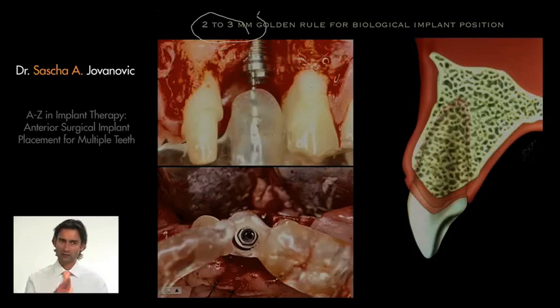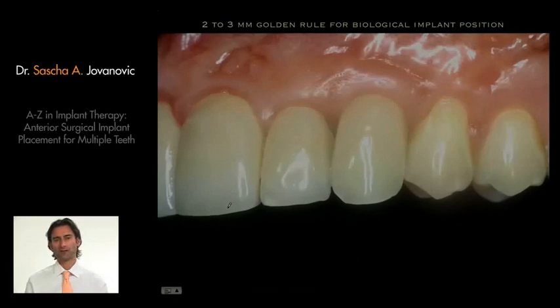So this doesn't change, single or multiple. The distance between the implant neck and the tooth doesn't change. It's always about 2 millimeters. So wherever the implant is close to a natural tooth, we're going to maintain about 2 millimeters. The buccolingual dimension doesn't change. We're going to go about 2 to 3 millimeters lingual from the contour of the tooth. So our goal is basically to maintain a thickness of bone on the buccal of an implant, which is about 2 millimeters. And this will allow us then to have a result, which is good.